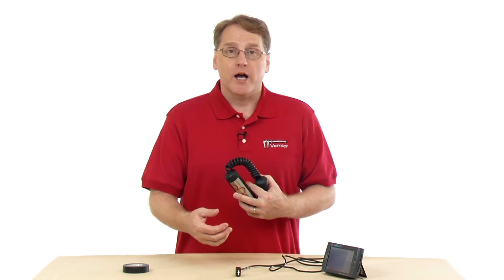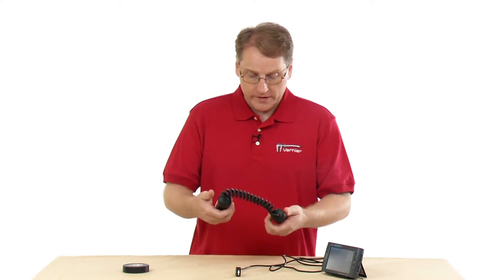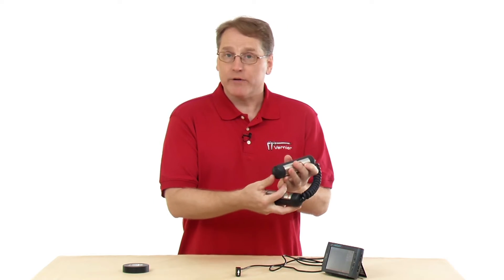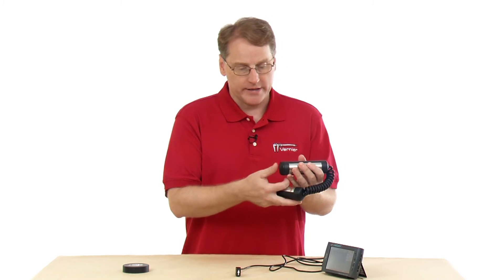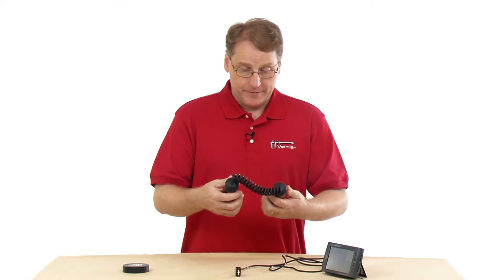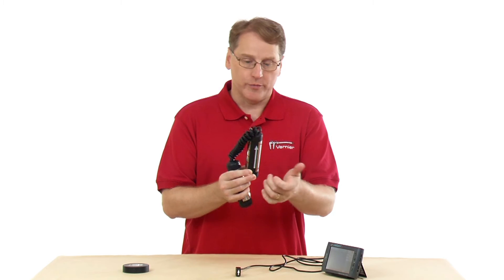It's also key that you keep this away from other devices that generate electrical noise. A computer, for example, can actually pick up the signal and give you an erroneous value. Sometimes we suggest taping the receiver down so it doesn't move. The hand grip unit has a battery inside that lasts several years — it's one of those flat batteries. If it goes bad, there's information in our technical library about the battery size and where to get it.